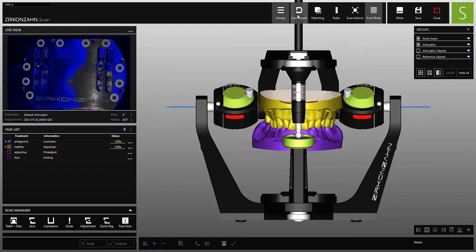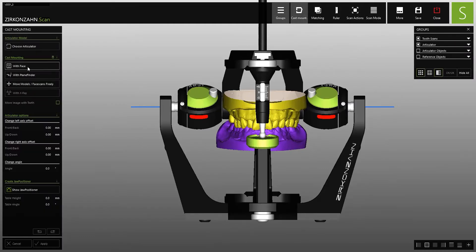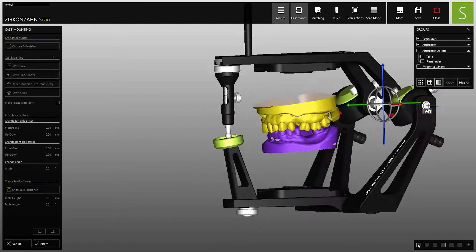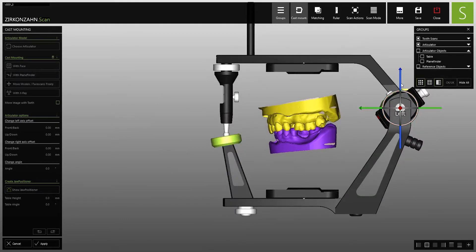In this case, the model position can be individually adapted on the basis of facial scans, plane finder data, or X-ray images.